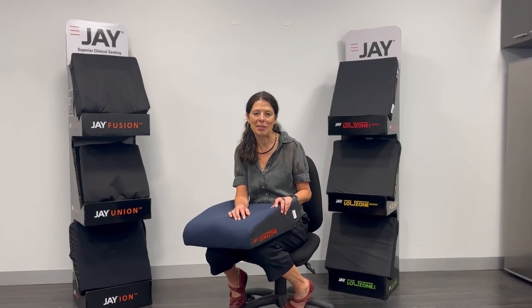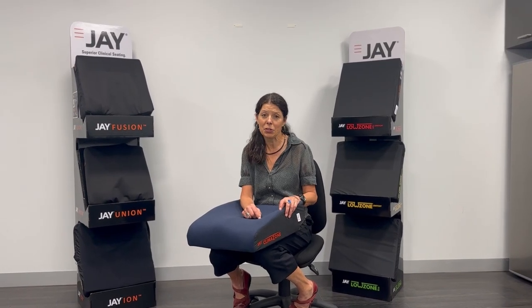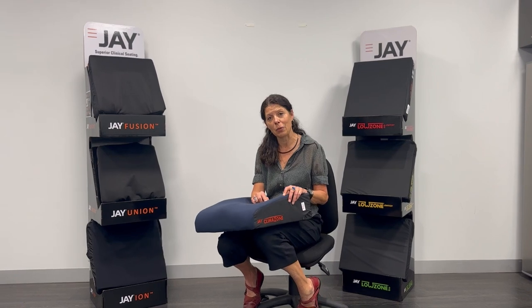Hi, Amy Bjornsson here from Sunrise Medical Australia. I'd like to introduce you today to the J Climazone Cushion.